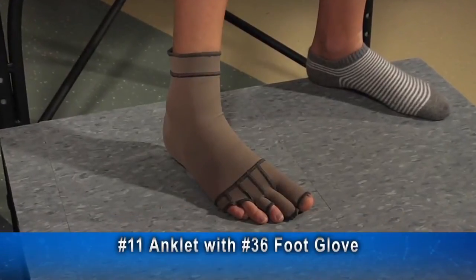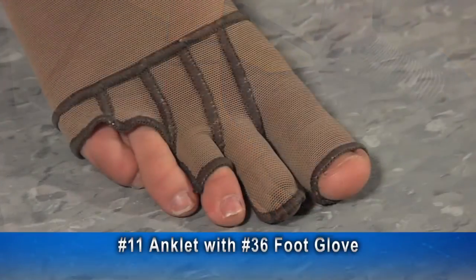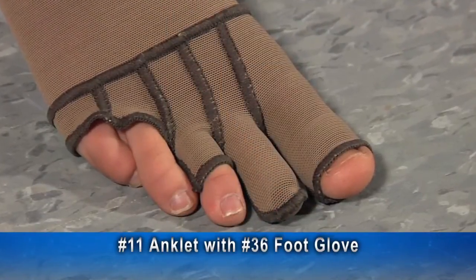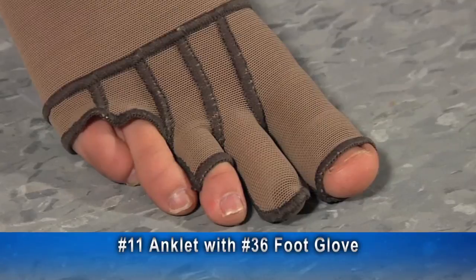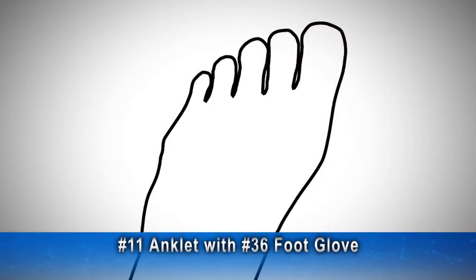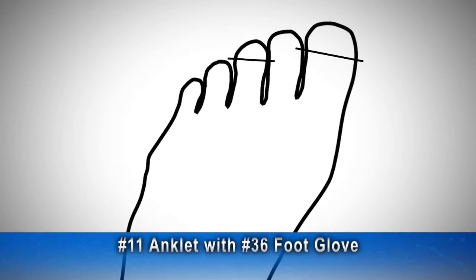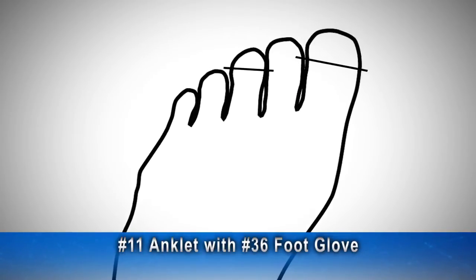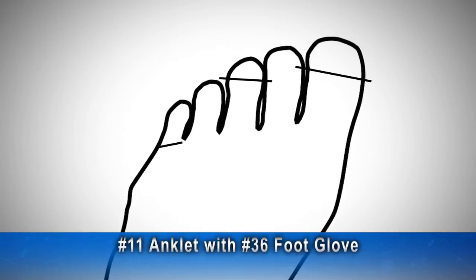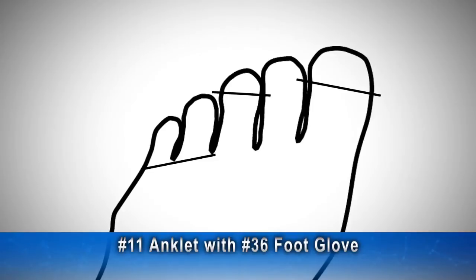Here is a number 11 anklet with a number 36 foot glove attached. This foot glove has a common opening for the fourth and fifth toes. The first and third toes are open, the second toe is closed. On the foot tracing you would send with these measurements, the first and third toes would have lines across them to indicate the desired openings. A line under the fourth and fifth toes would indicate the common opening, and the second toe would have no lines.